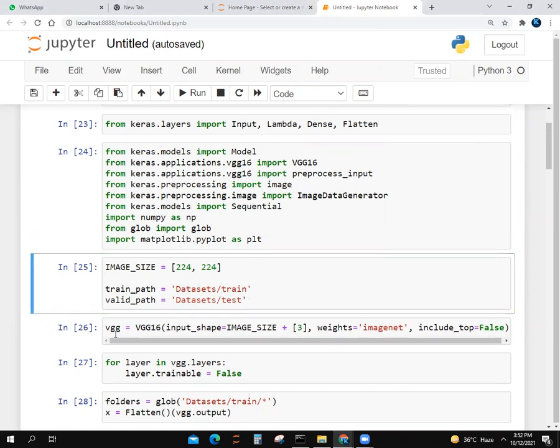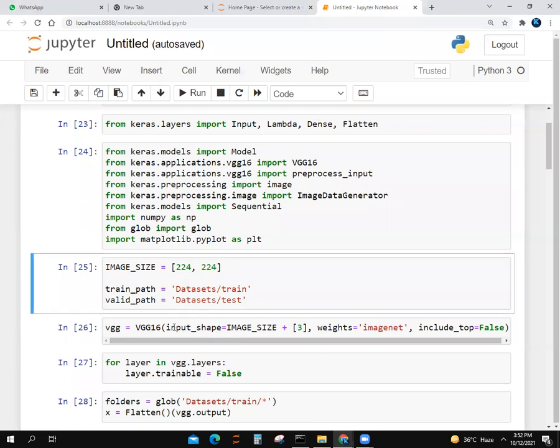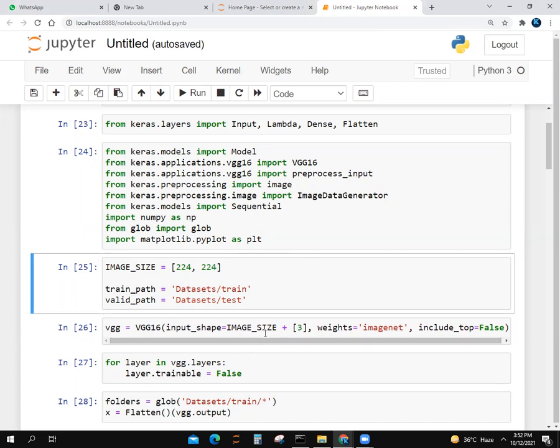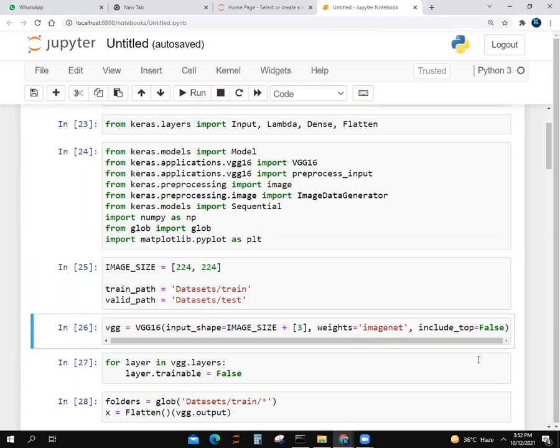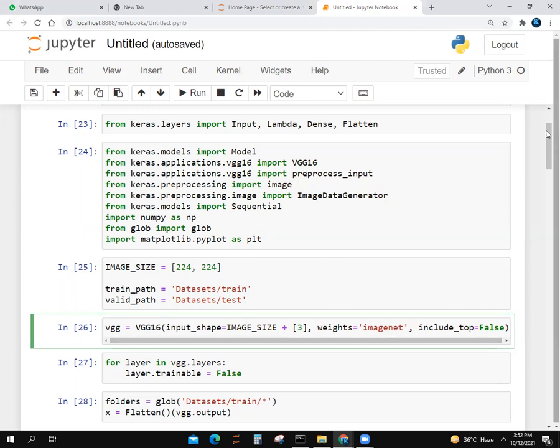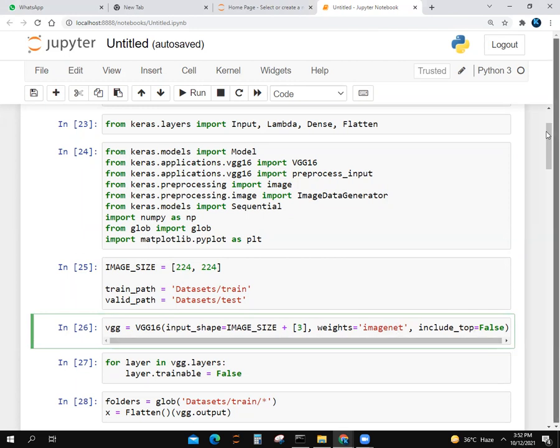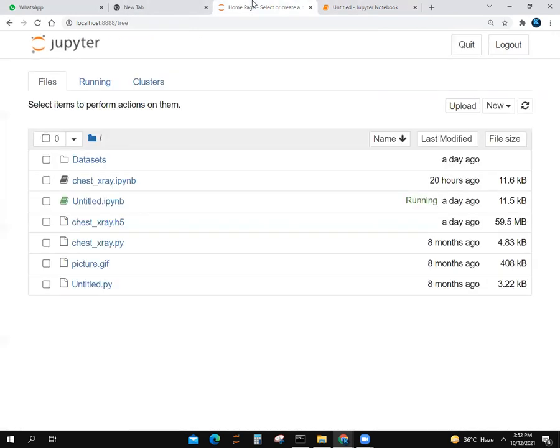We can set train_path and valid_path for datasets/train and datasets/test. We make a variable named VGG and call VGG16 with input_shape. The input shape includes image_size plus three. We set include_top to false and are importing images.